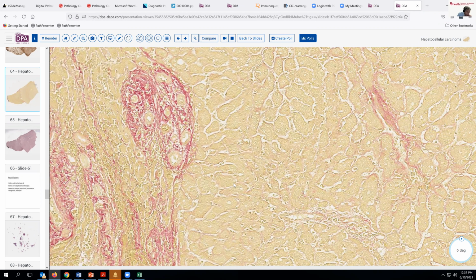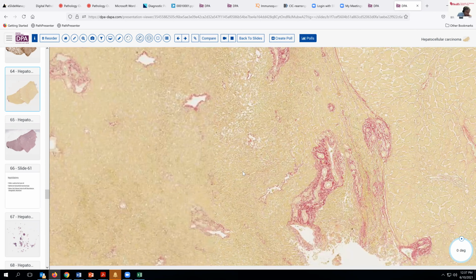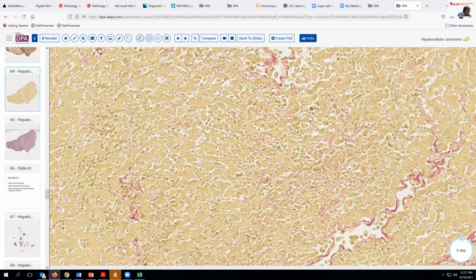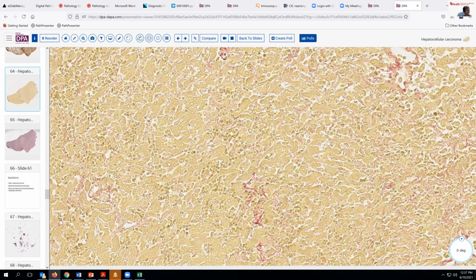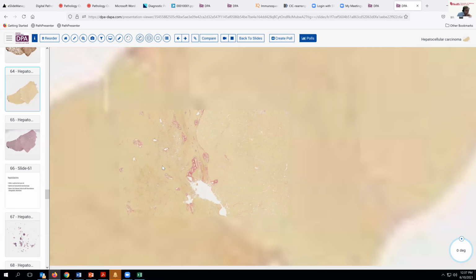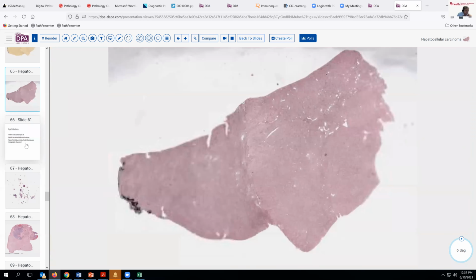Now I'm wondering if this got mislabeled because it's not highlighting things very well here, is it? Typically a bile stain will highlight little green dots of bile, and I'm not seeing that very well in this, either in the native parenchyma or the neoplastic cells. I have used that on occasion, but it has pretty much been supplanted by HepPAR and arginase.